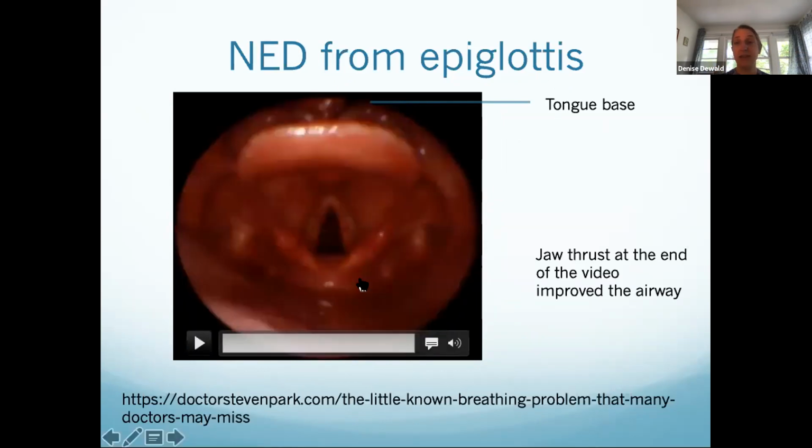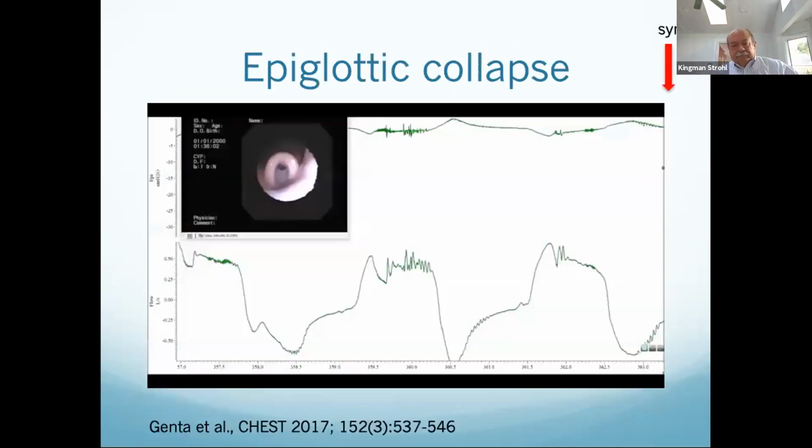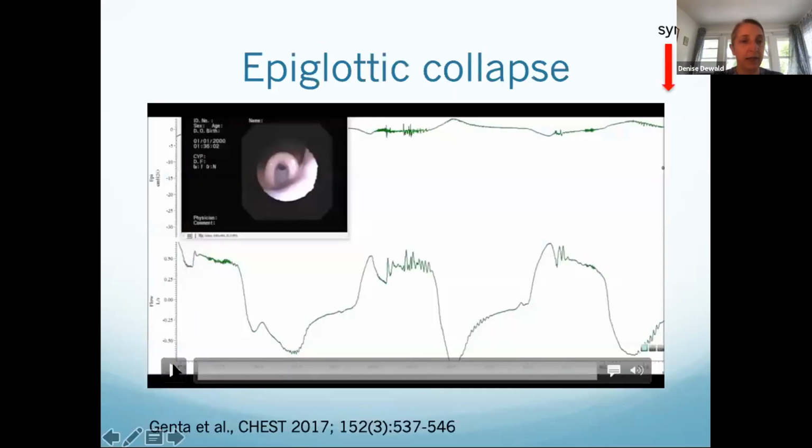And so you can imagine, with some people with sleep apnea, when you put a CPAP on, this epiglottis can act like a sail, and so some people will say, I can't breathe with a CPAP. This may be what's happening. It's not a lot, but that's what you have to listen for when you hear that. All right, and so this is what the epiglottis collapse looks like.